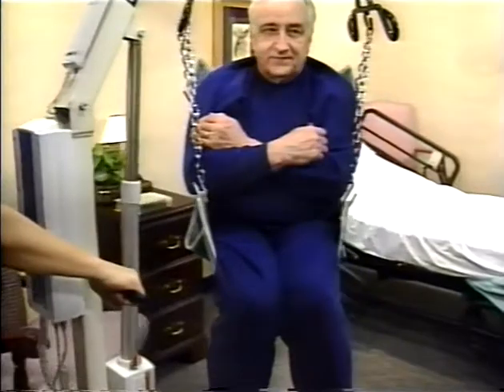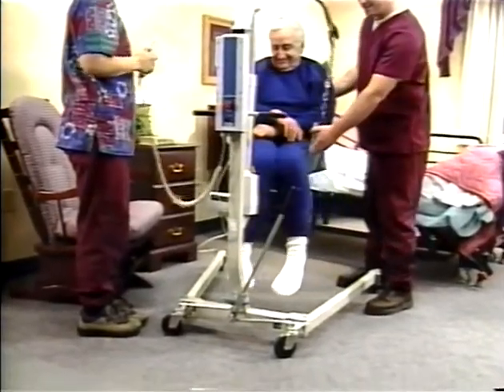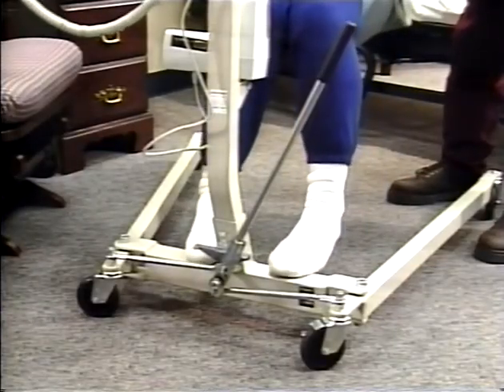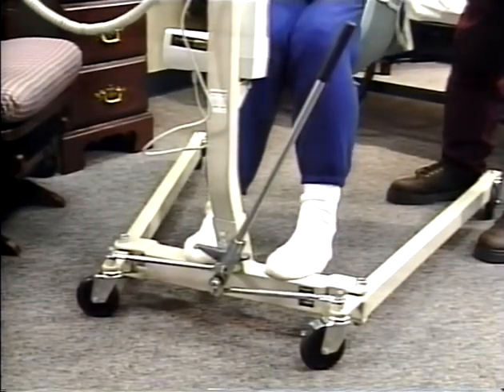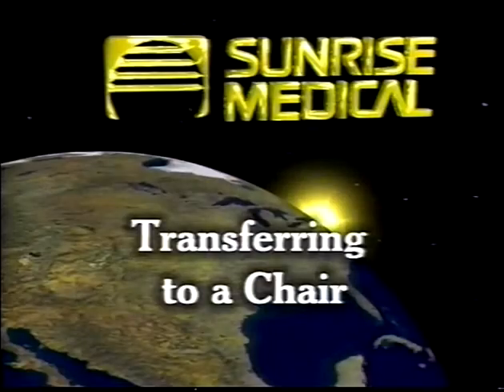Never push or pull on the boom or the sling. Always steer the unit with the handles on the mast. They're designed to make maneuvering the lift safe and easy for you regardless of your size. Place his feet on the base while you move him to his chair.